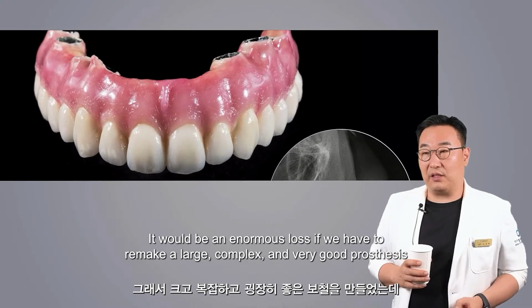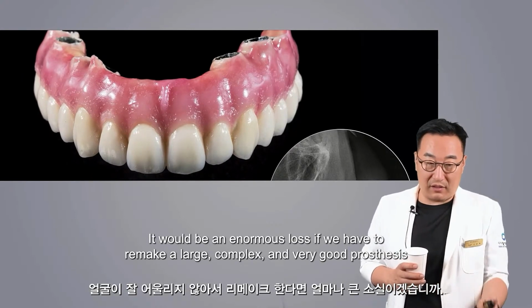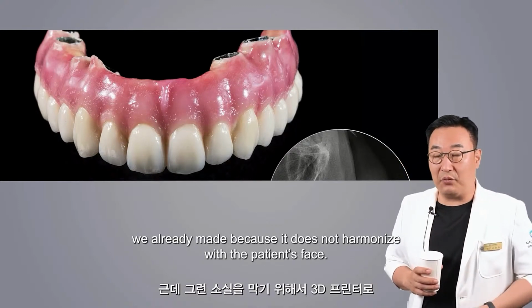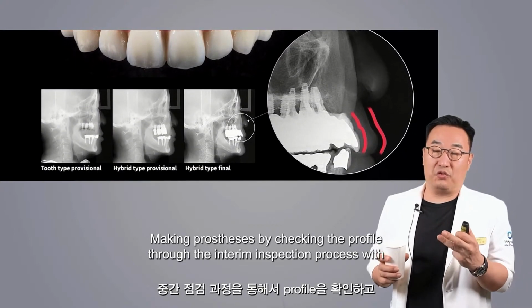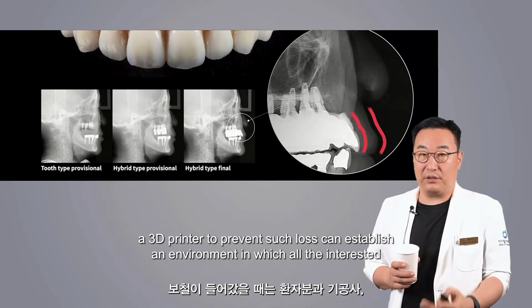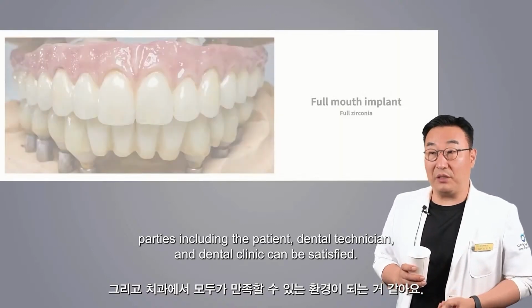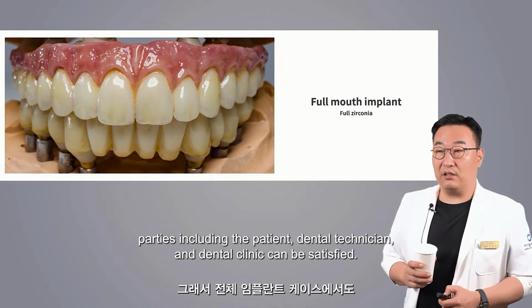It would be an enormous loss if we have to remake a large, complex, and very good prosthesis we already made because it does not harmonize with the patient's face. Making prostheses by checking the profile through the interim inspection process with a 3D printer to prevent such loss can establish an environment in which all the interested parties, including the patient, dental technician, and dental clinic, can be satisfied.